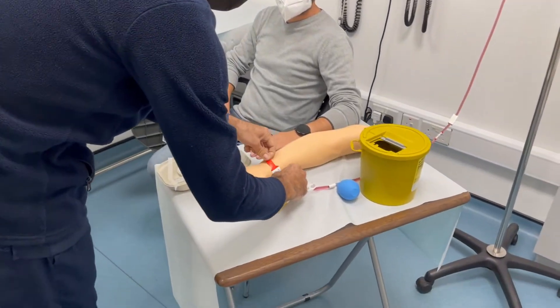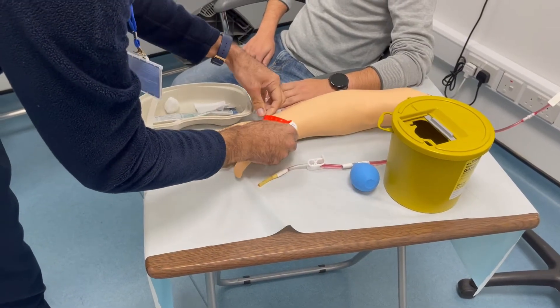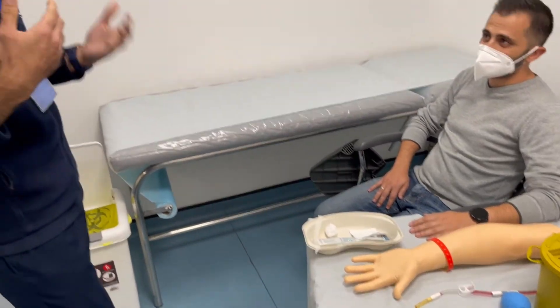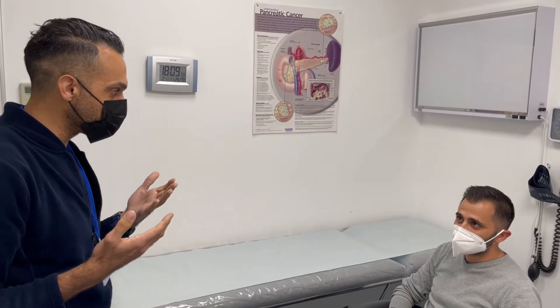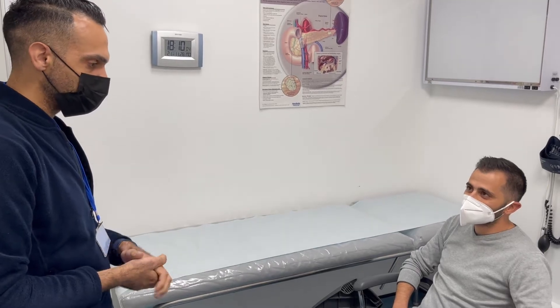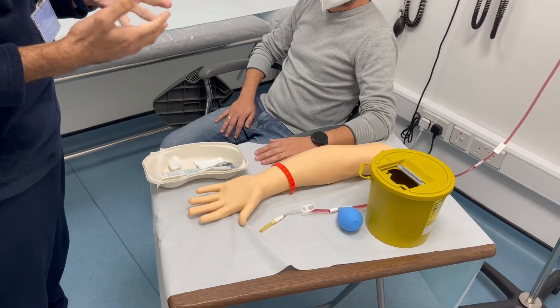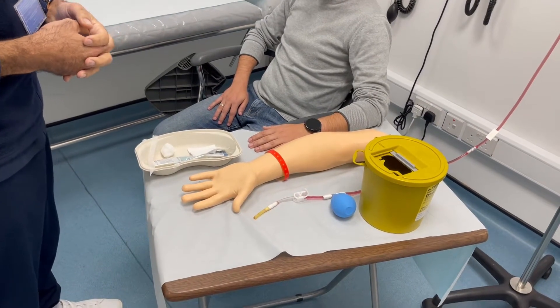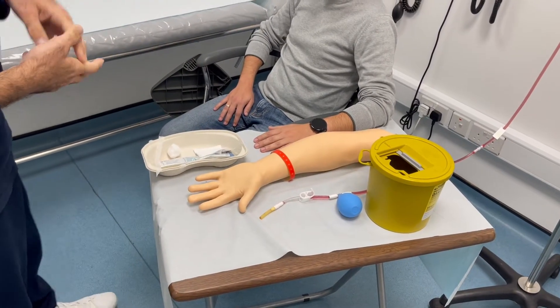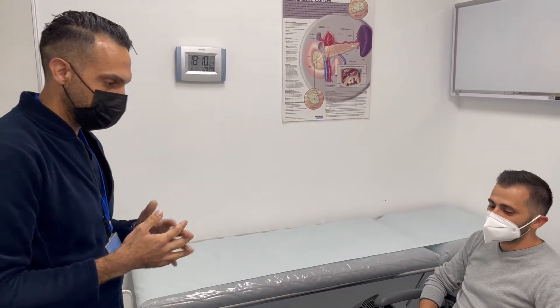So we're checking the patient's name, making sure that it matches the patient's description — perfectly fine. Before we get started, one of the things I'd like to do is inspect the arms. Do you have a preferred arm? No. The left one. Okay, perfect. I'll go ahead and inspect the arm. I don't see any signs of infection like cellulitis, no swelling or edema, no wrist fractures, and no AV fistulas or skin grafts that are visible. Have you ever had recent operations on your arm? No. Excellent.